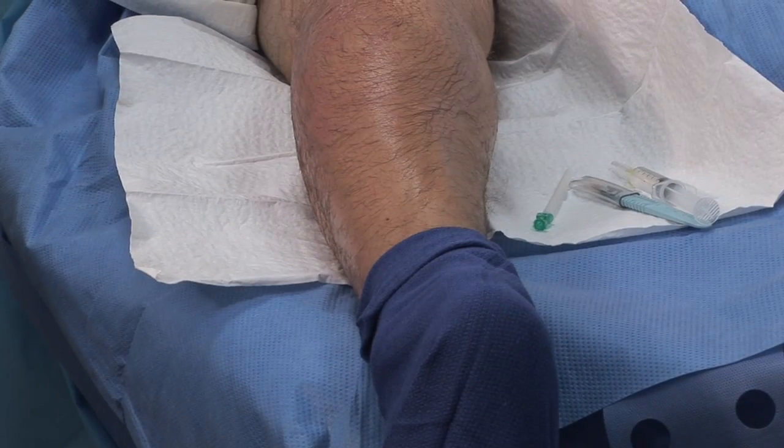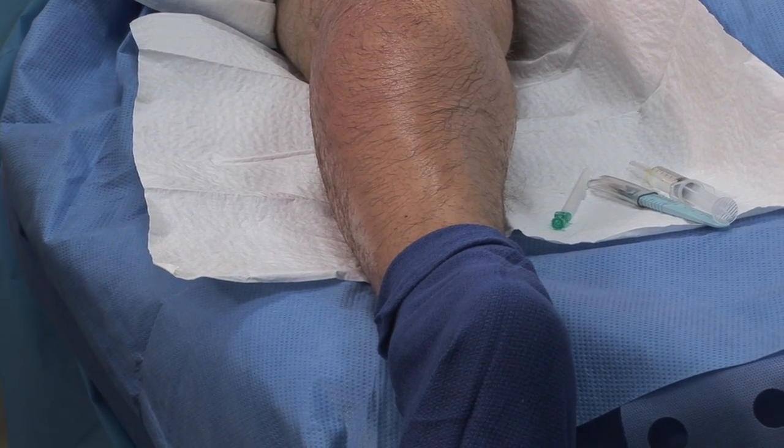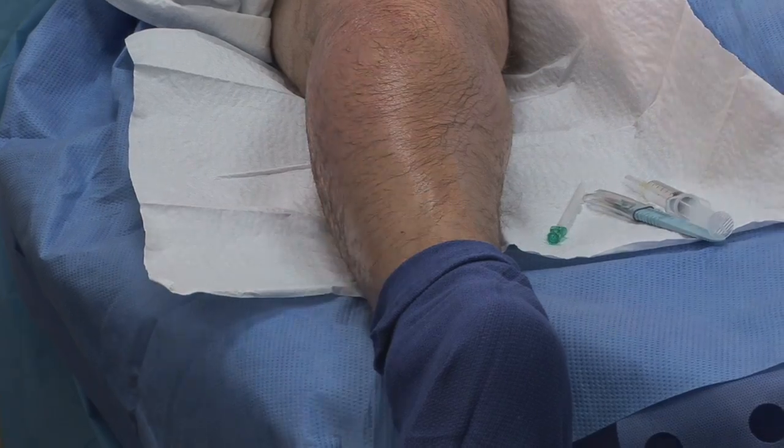This is Dr. Afshar. We are showing you a radiofrequency ablation on a small saphenous vein.